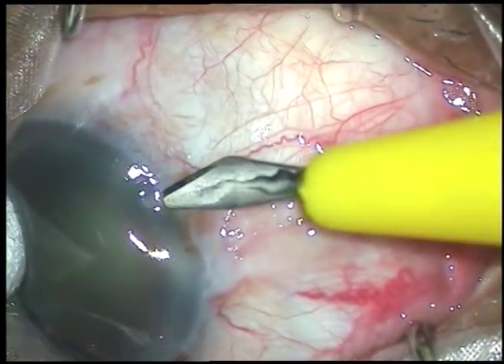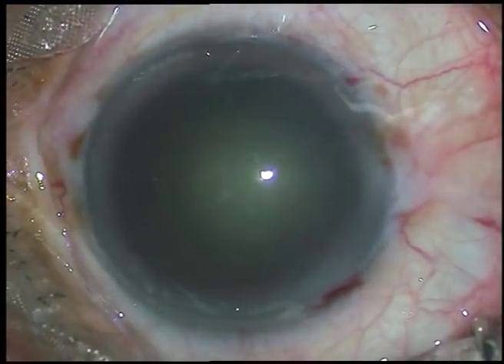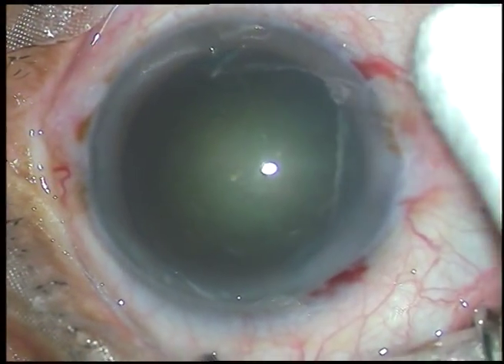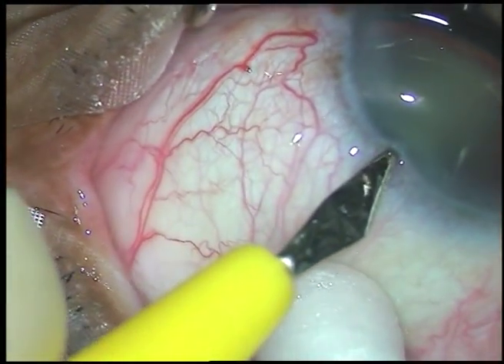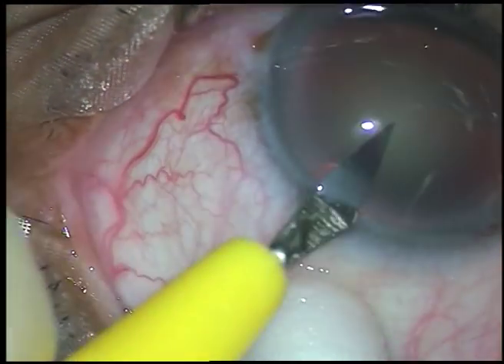Now this is a side port. See, there has been no leakage of aqueous humor even after the main incision. The trick is you come out with an upward pull.